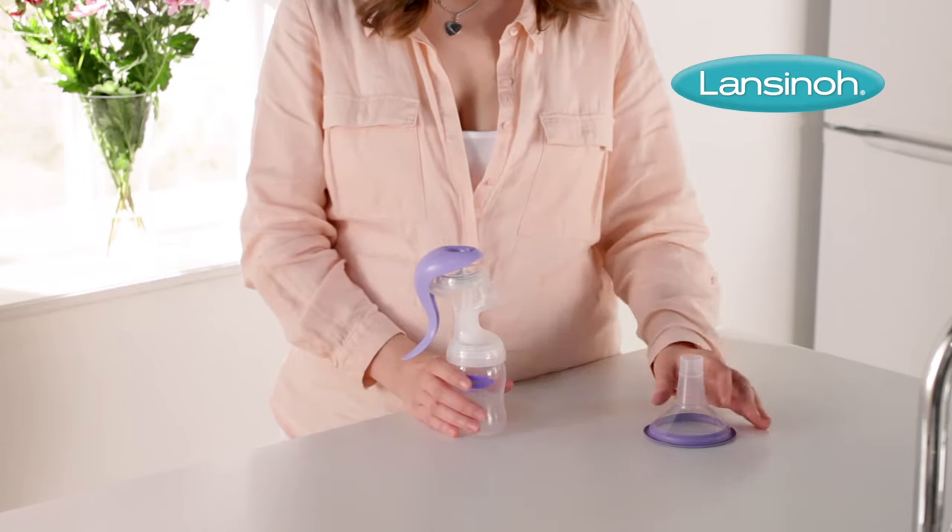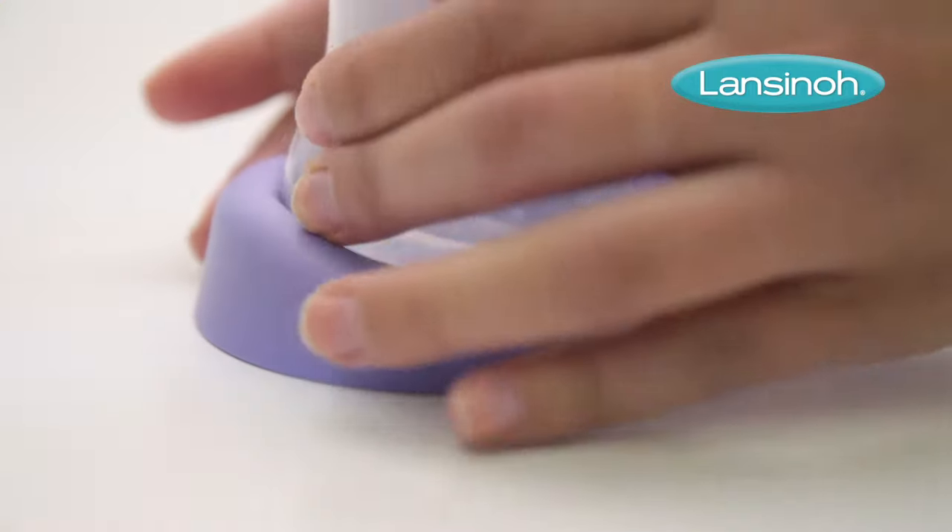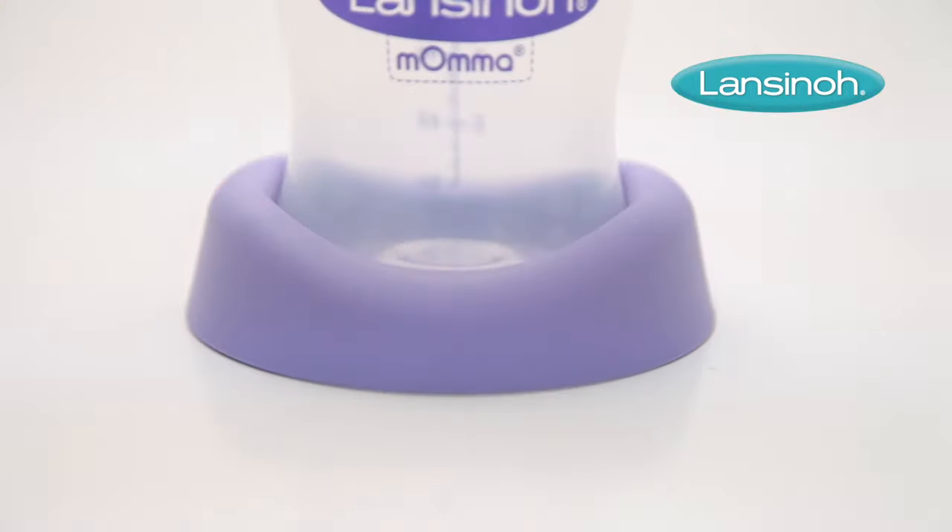Then attach the Comfort Fit breast flange to the pump body. To make the pump completely stable, insert the bottle into the stand provided.